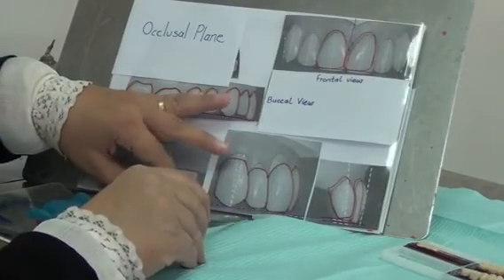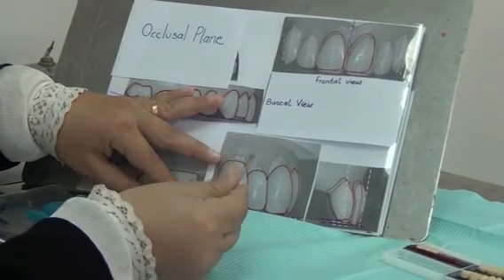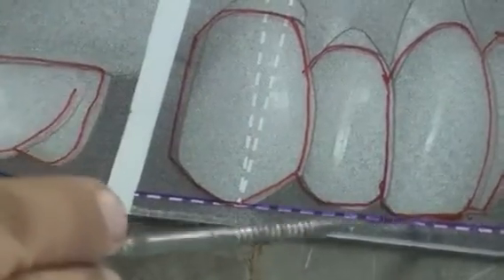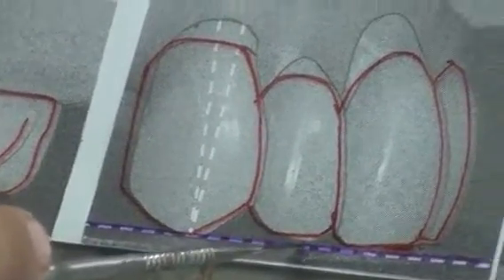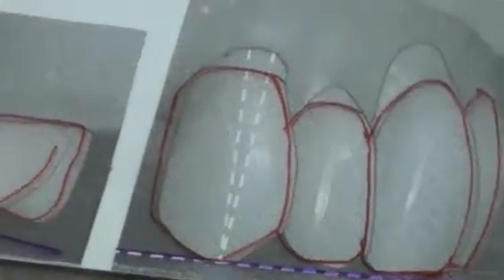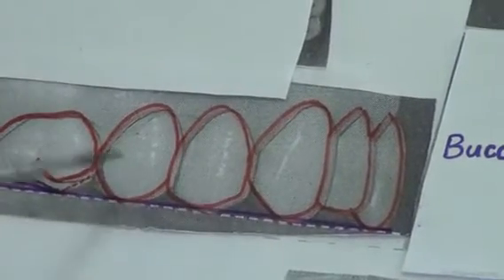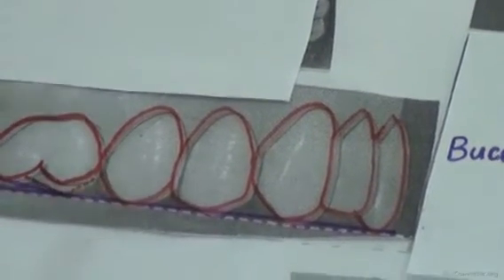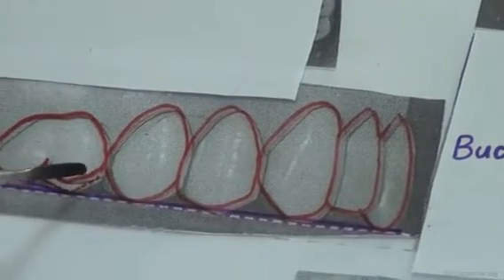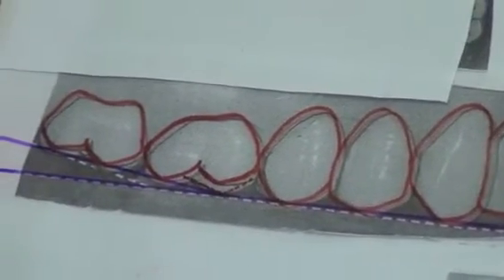And if I'm putting in the canine as well, when the canine is in, the canine is touching. So which teeth are touching the occlusal plane? Central is touching, lateral is higher than the occlusal plane, canine is touching. Now we go to the buccal view, looking at the teeth from the side. The canine is touching, the buccal cusp of the premolar is touching, the palatal should not be touching. The second premolar, both cusps are touching. For the first molar and second molar, both are not touching except the mesiopalatal of the upper.